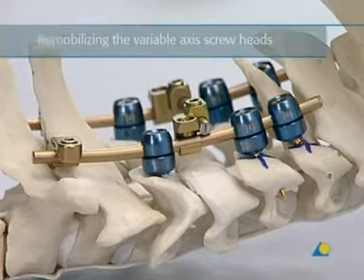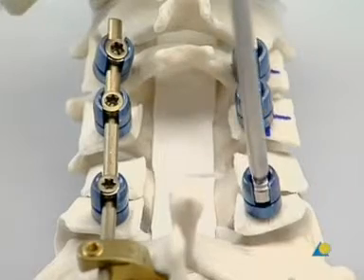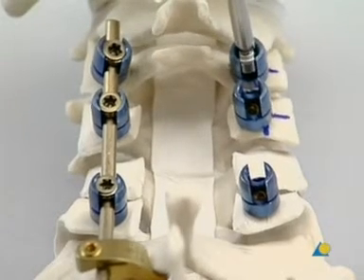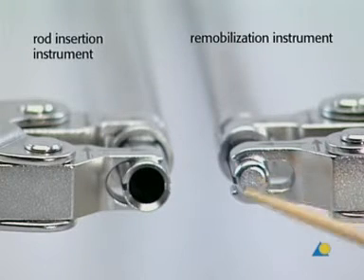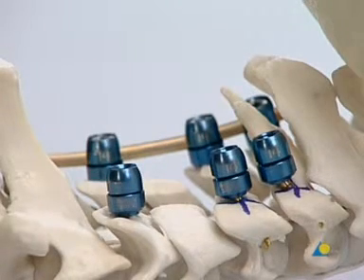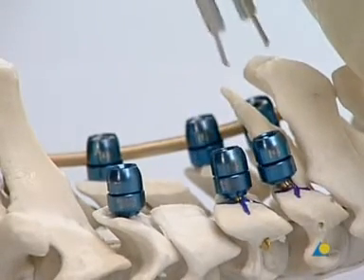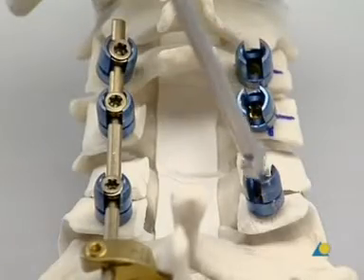Remobilizing the variable axis screw heads is necessary if the construct has to be adjusted. The locking screws and the rod are removed. The variable axis screw heads are still stable. To remobilize them, the remobilizing instrument is used. This instrument is not cannulated. It is placed over the locked screw head, the handle is squeezed, and the screw head is remobilized. This step is repeated on the other levels. The screw heads are once again freely mobile.